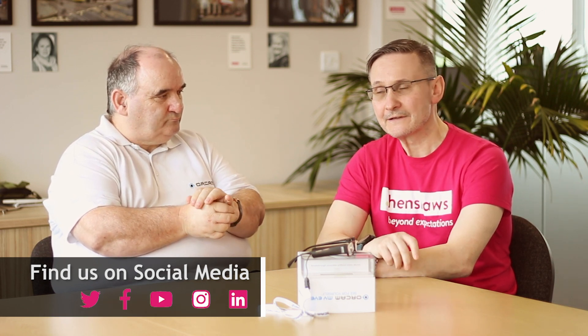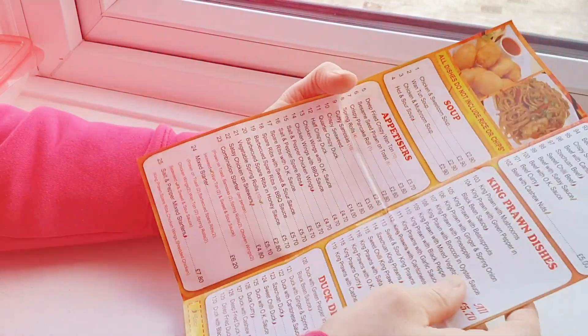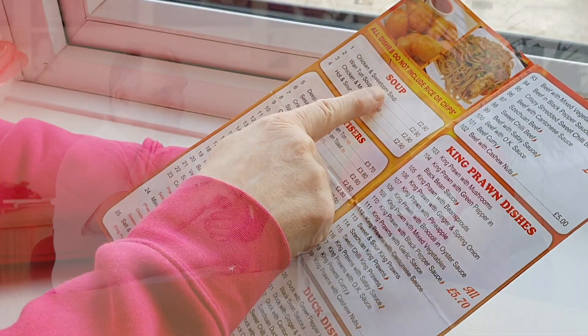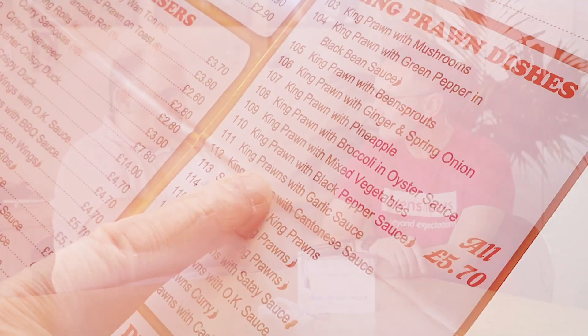The second way is you can tap the touchpad on the side of the OrCam and it will take an image of the text and read all the text it sees. Then there's touch reading, where you can navigate to find what you want to read. For example, in a restaurant with a menu, you place your finger on an item and the OrCam focuses three lines of text above the tip of your finger and starts to read as you move your finger slowly down.